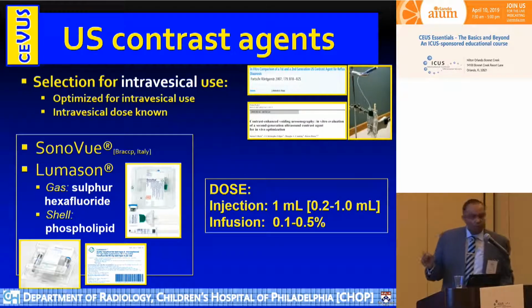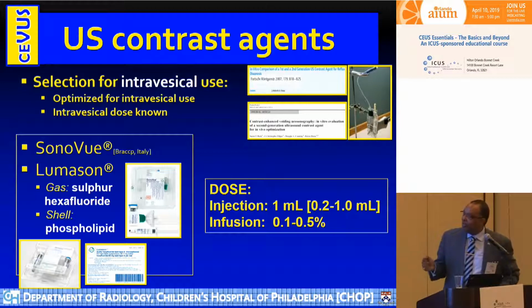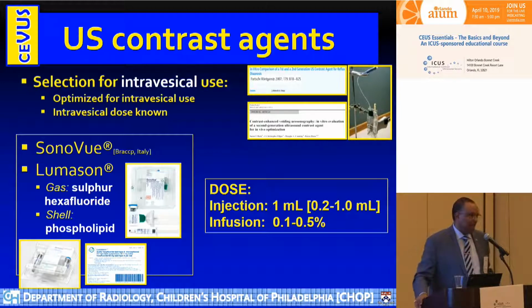When the FDA approved the contrast agent, they put in their leaflet that you should use a dose of 1 ml. So if I may correctly say, the FDA approved primarily based on the grounds of the evidence you provide and the current existing evidence.